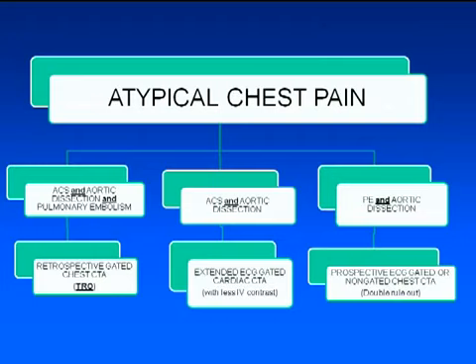If you think the patient may have acute coronary syndrome and dissection, you can do a cardiac CTA and extend your field of view to the level of the arch to look for dissection, but you're not really thinking about PE. And the topic today is about triple rule-out. So if you think the patient might have acute coronary syndrome and dissection and PE, one of the three or all of the three, for that matter, you should do a triple rule-out CT.